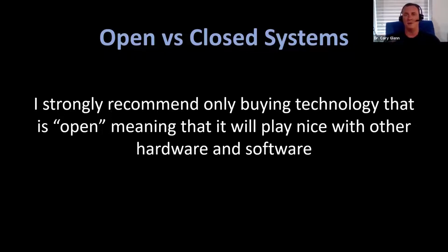And yeah, if you're all in and you buy the entire CEREC system, it's excellent. It works really well. They've done a great job of simplifying that whole workflow. Again, it just comes at a premium cost. So it's a matter of opinion here, but I am very much to the side of the spectrum that recommends using open source stuff, because I just don't see that the cost savings are there anymore for trying to do all your lab work in-house at those really high prices.